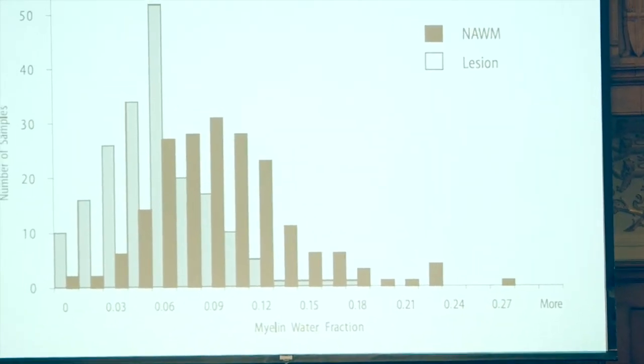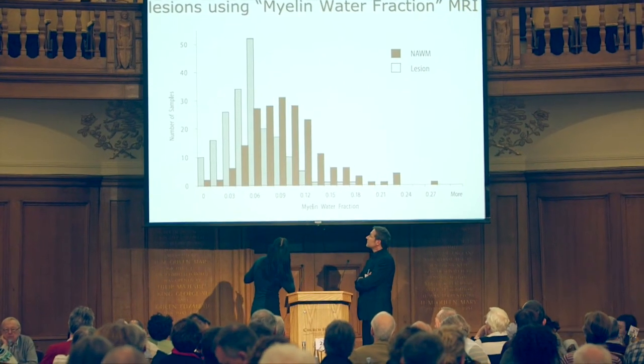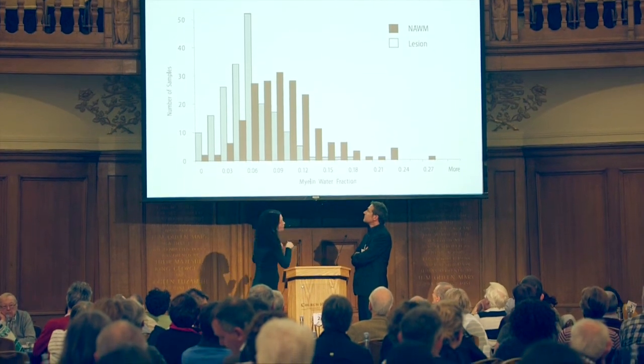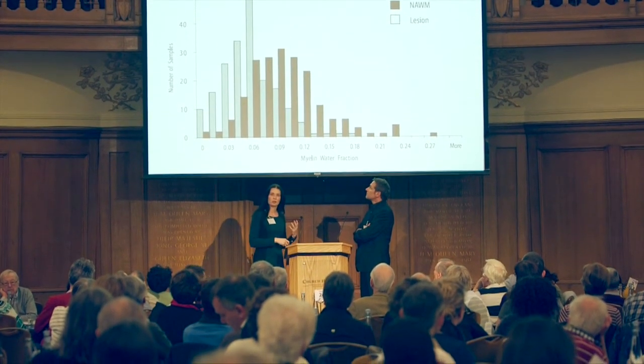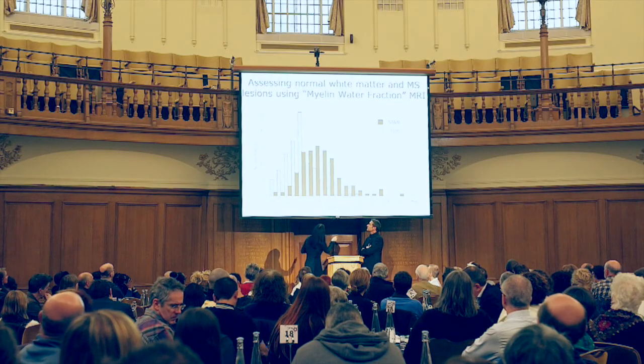Okay, so what does that mean to you, apart from the fact that we might be able to get a quantitative map of the myelin in a demyelinating disease? So that's quite good. Here we have curves. So whilst you're on your drugs, we're monitoring your drugs, you're on a clinical trial, I can take a sample of the myelin water fraction.